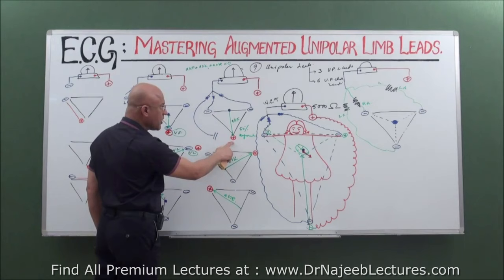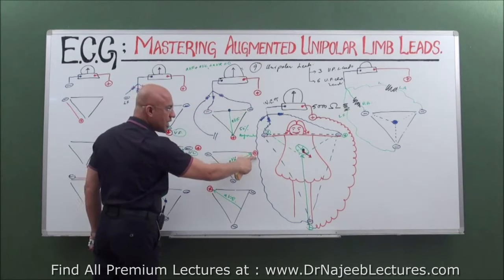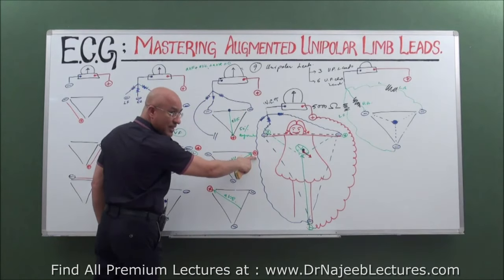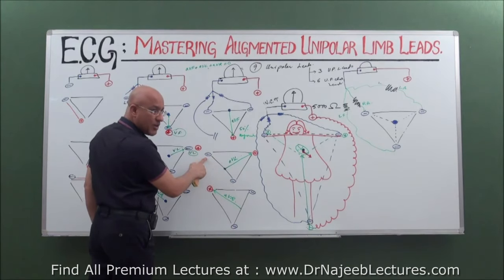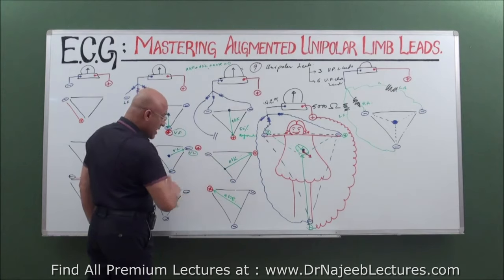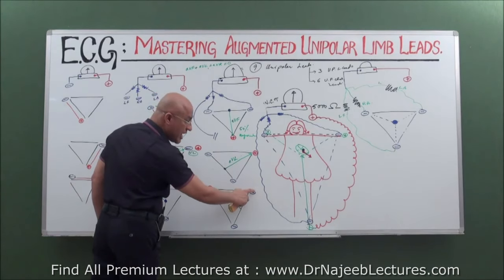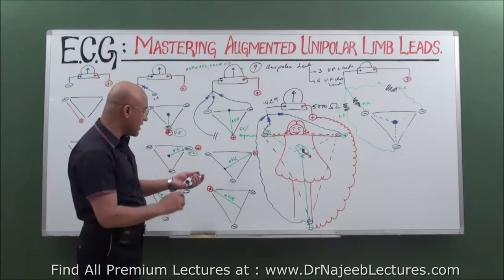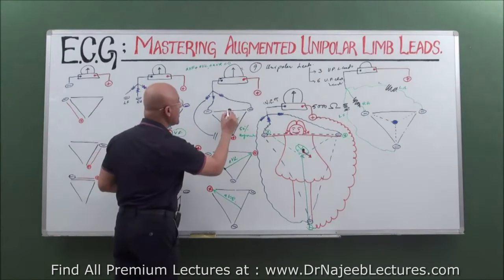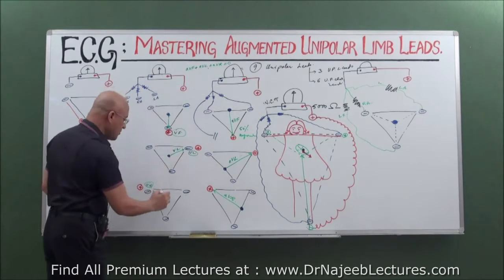If you put positive on the foot, the indifferent electrode is between the right and left arm. If you put positive on the left arm, then the indifferent electrode is made by the other negatives from the foot and the right arm. If you put positive on the right arm, then the indifferent electrode shifts between the left arm and left leg. So it means the Goldberger electrode is variable. You understand it? And Wilson is fixed.